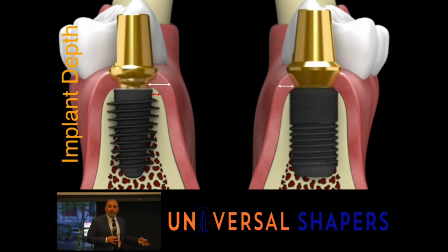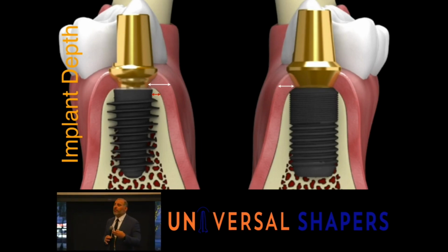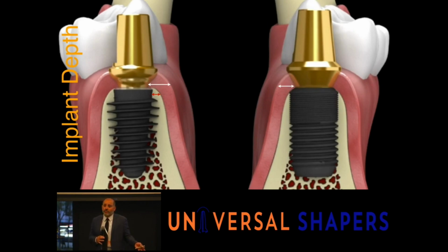In the wider situations, they work perfectly. But in the more narrower situations, that's where we have to start choosing a type of implant that can accommodate that bone, or we have to augment. It's just that simple. And there's nothing wrong with using either implant. They both work. You just have to know how to use them and how to accommodate the scenarios that you may be faced with.